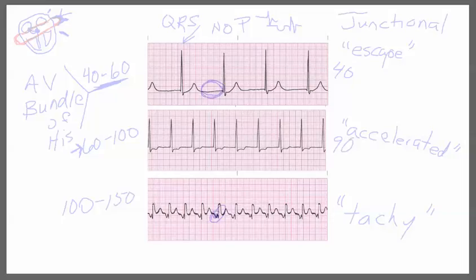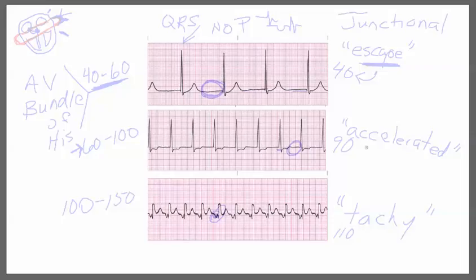On the third strip, counting the complexes gives us about 10 to 11, so this is about 110 beats per minute. The QRS is still narrow, there are no P waves, and it's consistent across the entire strip. So the first strip at a rate of 40 would be referred to as a junctional escape. The second strip, beating at an accelerated rate of 90 with no P waves and a narrow QRS, is considered accelerated junctional.